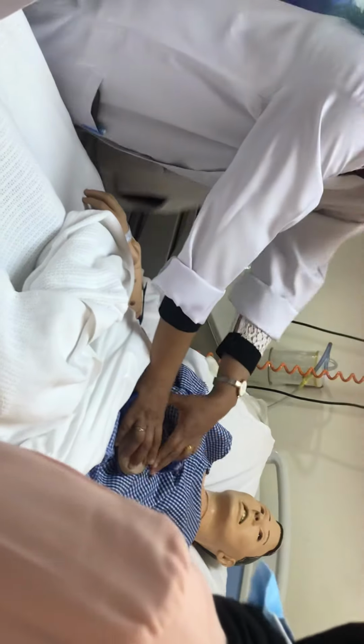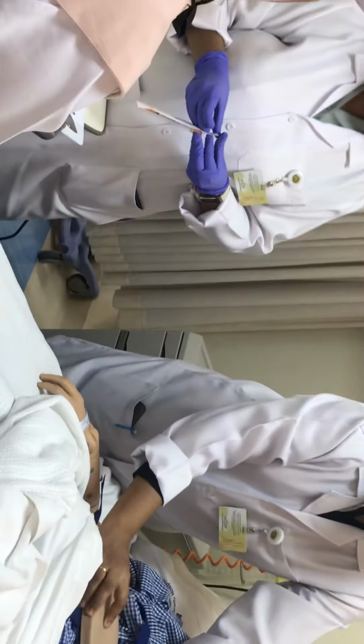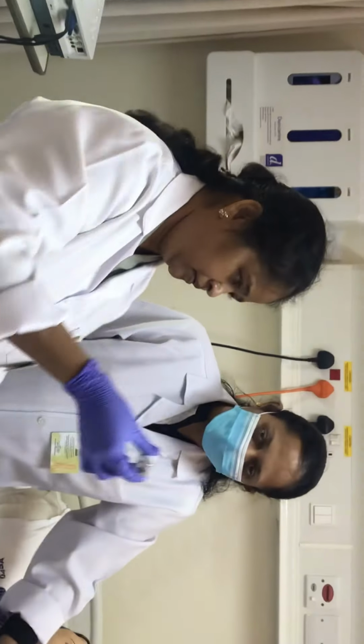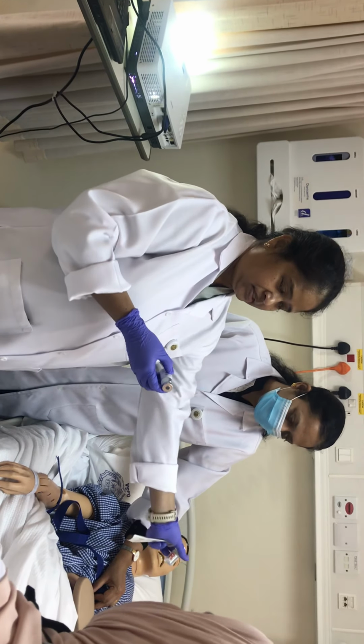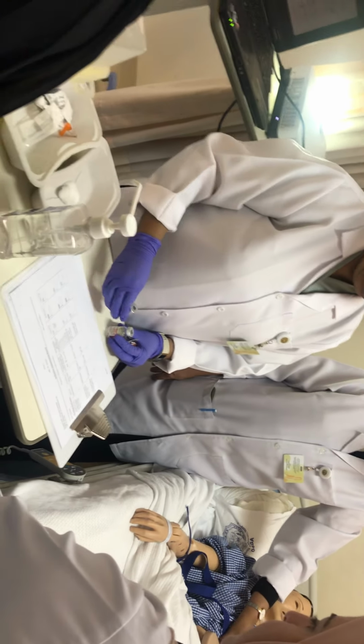Okay, cleaning everything same. I'm going directly to the procedure. 3 checks, everything should be done. Now before that, you can see the cloudiness. One is cloudy. Always N is cloudy. Okay, this regular is clear. So you should make them remember something.